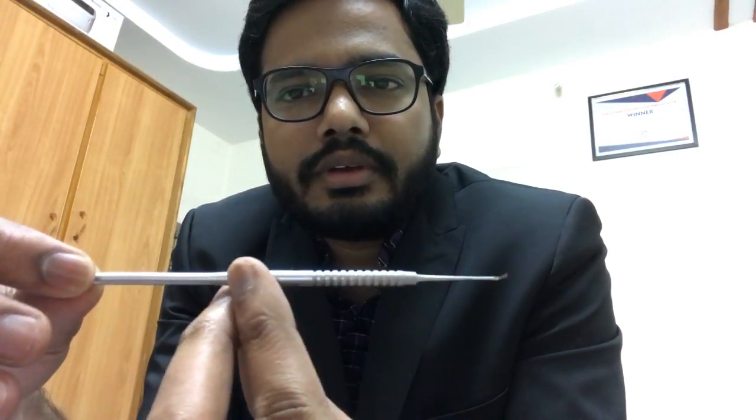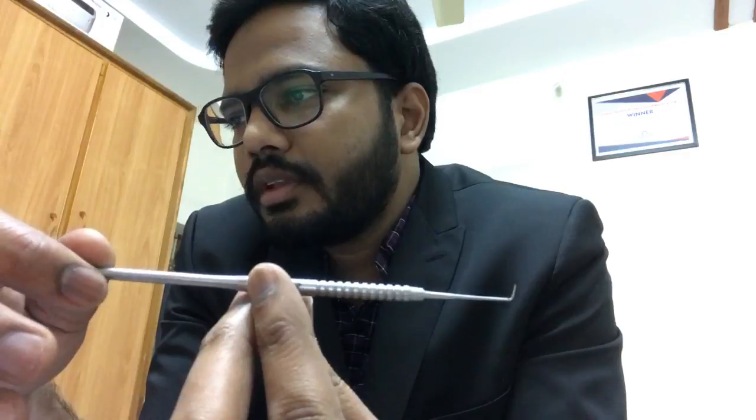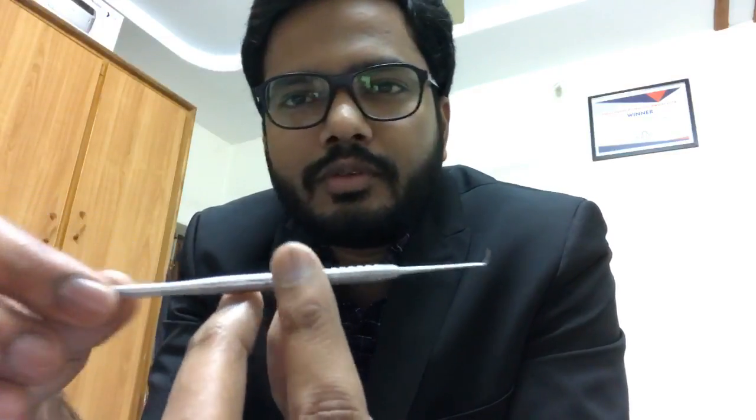So what is this instrument? Bernice, you say hoe. Abhishek says hoe. Rakesh, it's not hoe. Then what is this instrument? So as you can see, we have single-ended and double-ended instruments, right? So obviously it's a single-ended instrument. And let me just give you a hint, it's a kind of excavator.